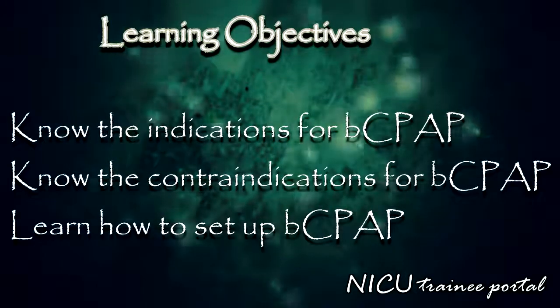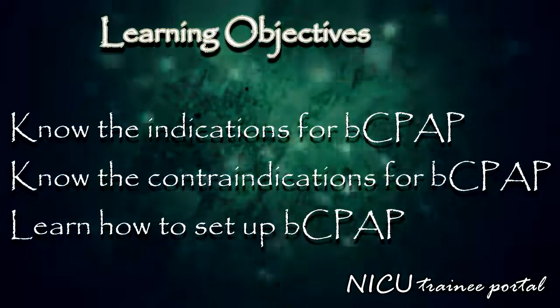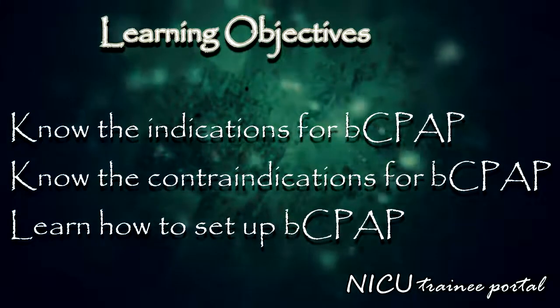The learning objectives of this module are to know the indications and contraindications for bubble CPAP and to learn how to set up bubble CPAP on an infant in the delivery suite or neonatal intensive care unit.